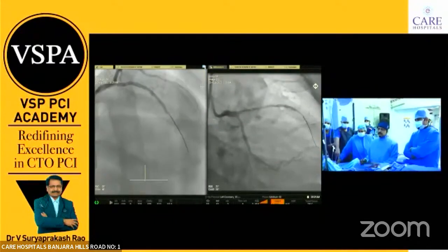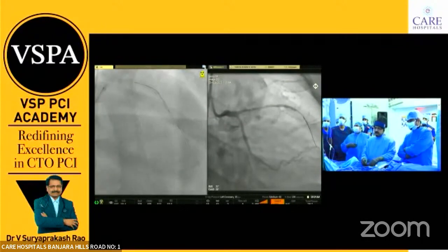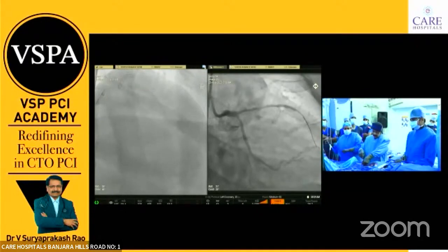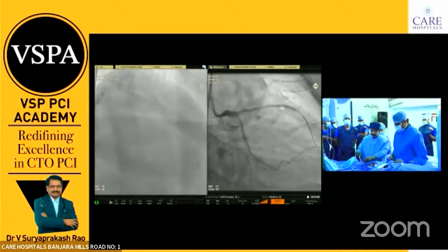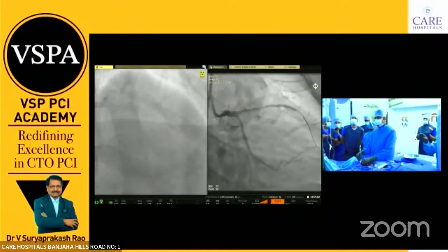And that is diseased. I think we have done the job here. You take good contrast, give one cranial and one caudal. Good injection. Ask him to focus properly.